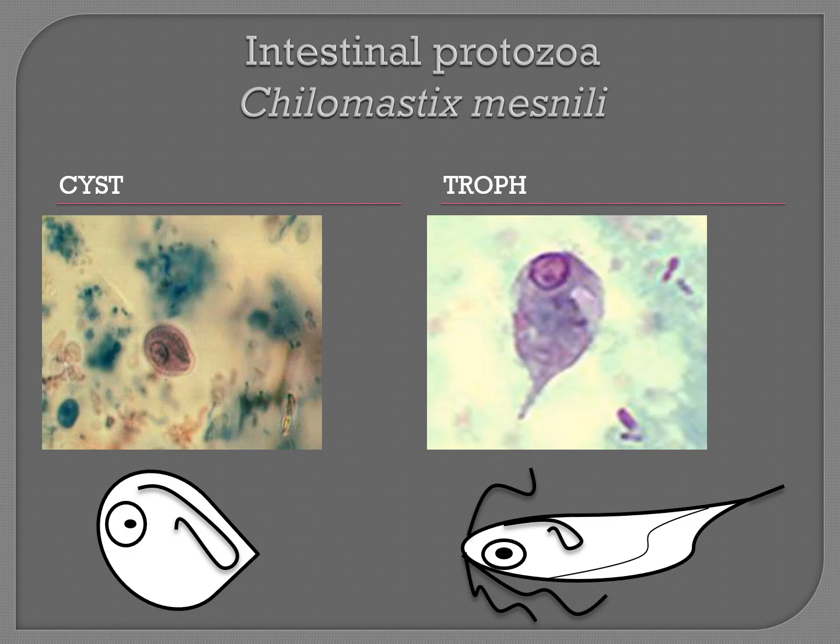It's a little bit bigger than yeast at about 10 microns. Okay, the troph is very stretched out. You can see that it's kind of pointy at the posterior end, and that has to do with its torpedo-like motility. You can see that it has one nucleus with no peripheral chromatin, and that has shifted to the anterior portion of the protozoan. You can also see a little tiny bit of a flagella coming out of that anterior portion just on the upper left. But usually it has several flagella that come out of the anterior portion of the protozoan.